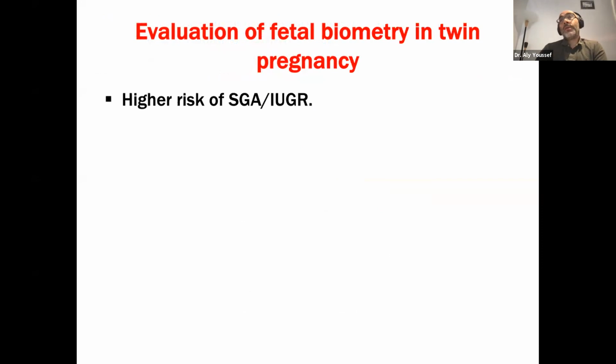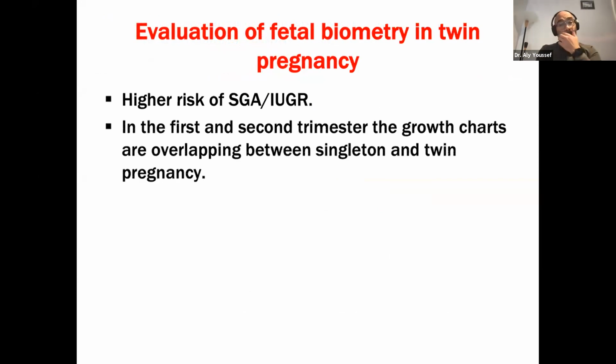Okay? A very important and also debatable aspect of the assessment of twin pregnancy is the assessment of biometry.